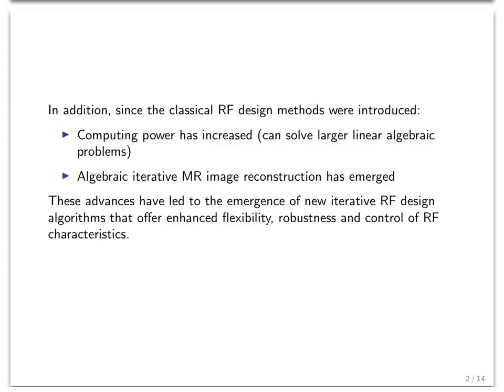Even so fast as that, we can actually do it live on the scanner. And the other development is that we've had a lot of development, especially in the early 2000s to mid 2000s up till now, in algebraic iterative MR reconstruction. That is exactly the kinds of iterative reconstructions that you've done on the homework so far. So those have really emerged and started to dominate MR image reconstruction, at least in research. They haven't found a lot of applications clinically yet, but they're used extensively in research.